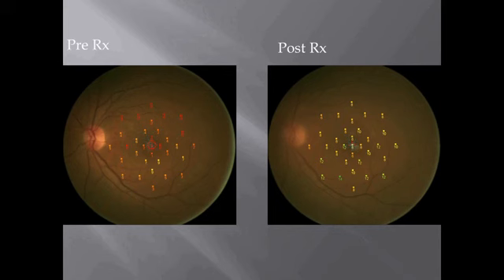So I think if you combine the use of all these things, the OCTs, the microperimetries, and you have lasers to treat conditions, in a combined way, you can use the technology much better to do the least collateral damage and still achieve a satisfactory vision for the patient.